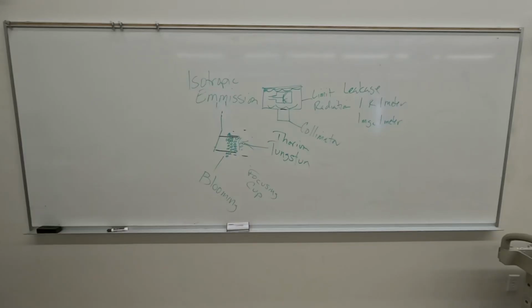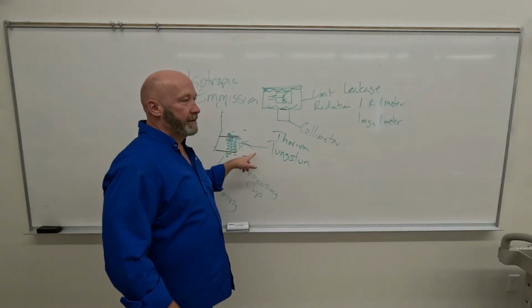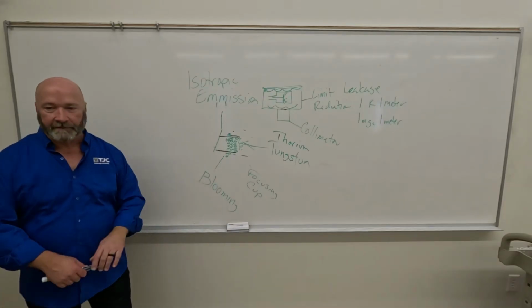Anode. So we're going to talk about that again in a minute, and we're going to use it in the anode for some of the same reasons and some reasons that are a little bit different as well. All right. Let's see, the other thing. Okay, so high melting point, but we're still going to melt the filament eventually.